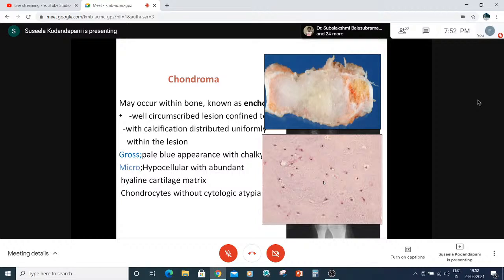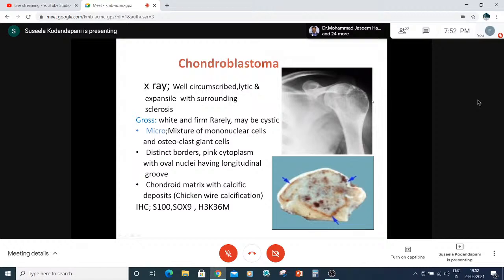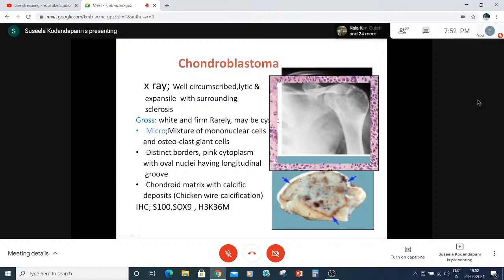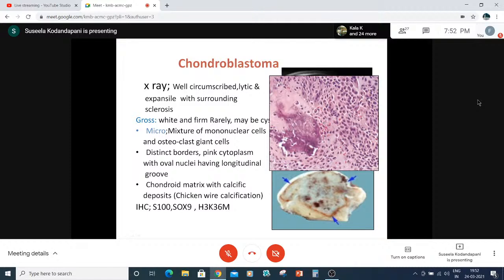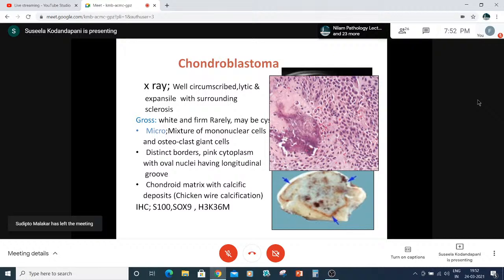Microscopy of chondroma: it is hypocellular with abundant hyaline cartilage matrix, and chondrocytes show no atypia — indicating a case of chondroma. For chondroblastoma: the X-ray shows a well-circumscribed lytic, expansive lesion with sclerosis of the border. Grossly, it is white and firm, and rarely may show small cystic areas. Microscopically, there is a mixture of mononuclear cells and osteoclast giant cells with distinct cell borders, pink cytoplasm, and a longitudinal nuclear groove. There is chondroid matrix with chicken wire calcification. IHC: neoplastic cells are positive for S100.